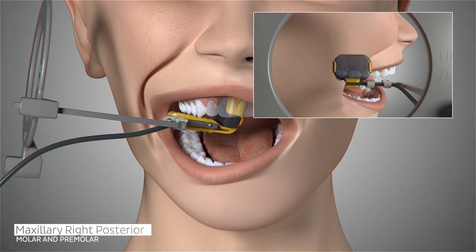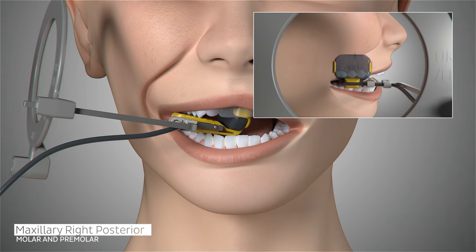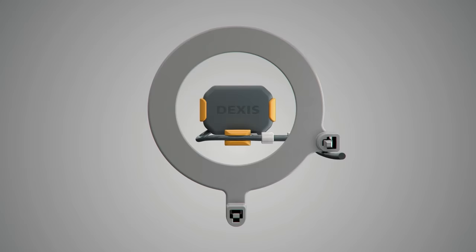Ask the patient to open slightly and gently slide the sensor forward so the contacts of the first and second premolars are centered on your sensor. The sensor should be placed far enough forward to capture the distal of the canine. Ask the patient to gently close, position the cone of the x-ray emitter, and trigger your exposure.